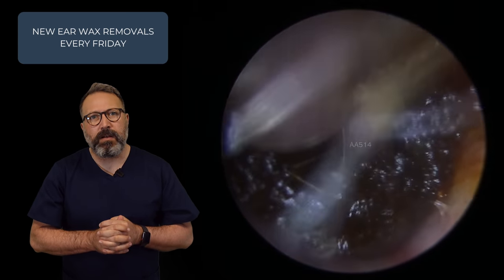Let's hope we can detach this enough to get a bit of a wiggle going. If you do hear some other voices, it's because the clerking team are next door to my office doing all the clerking for new patients. Oh, it's moving now — that was a good chunk right in the middle there. So that central section has come away. Now that should leave a looser piece at the top and the bottom, which may give us a little bit more wiggle room in here.